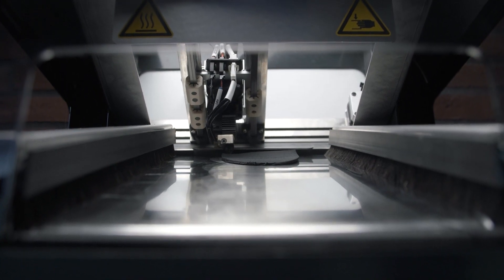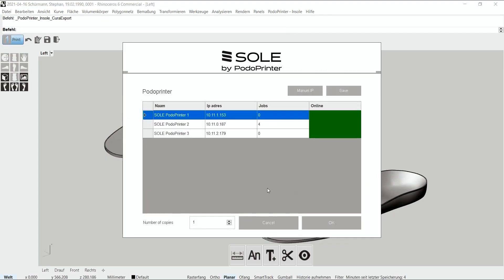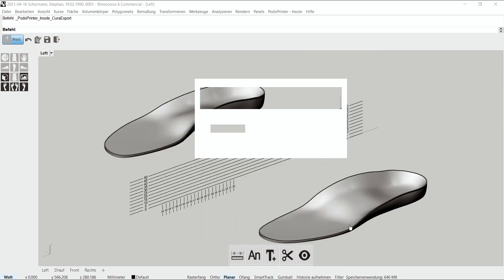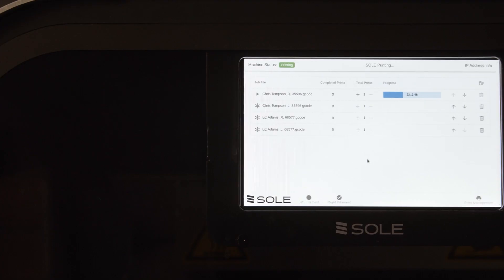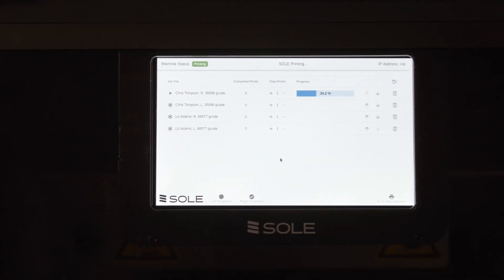PodoCAD connects automatically with the machines, where we assign one machine for production. With the push of a button, we send our designs to the printing queue.